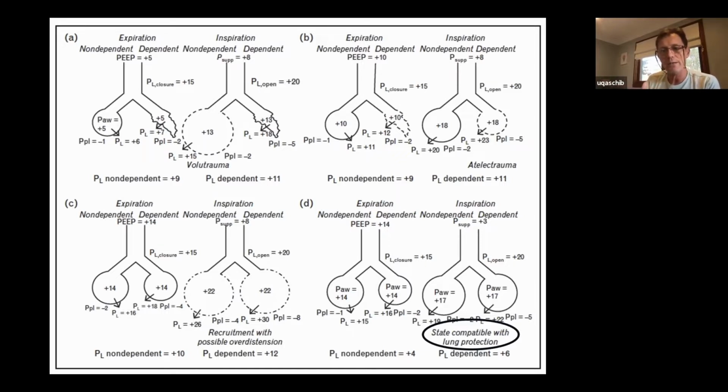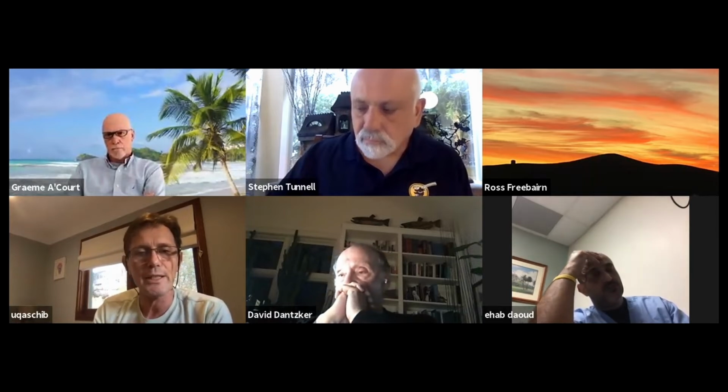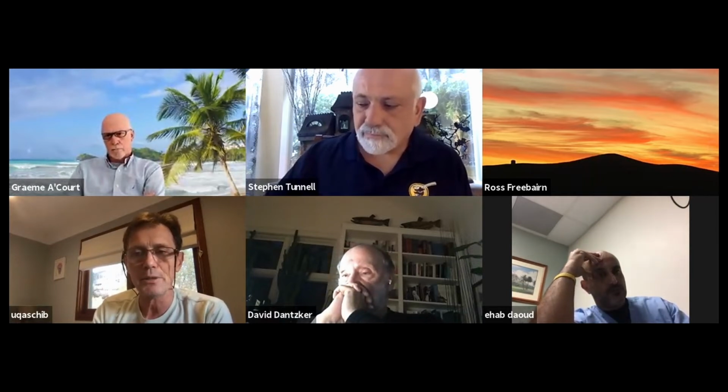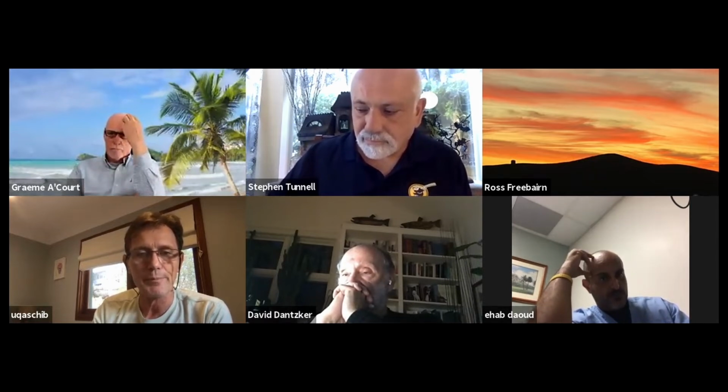And with not enough PEEP, we further injure this compartment by closing, opening, closing, opening. And that was what Lachmann, about 30 years ago, said: open the lung and keep the lung open. So you don't have this cycling, injuring scenario occurring.